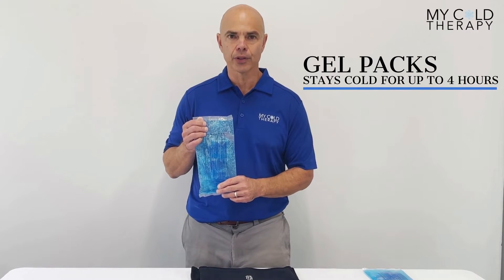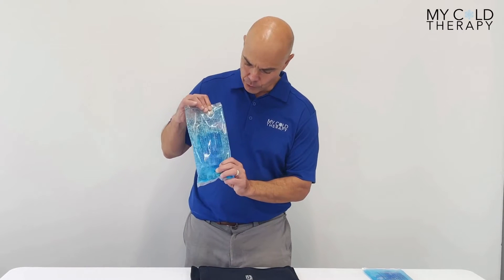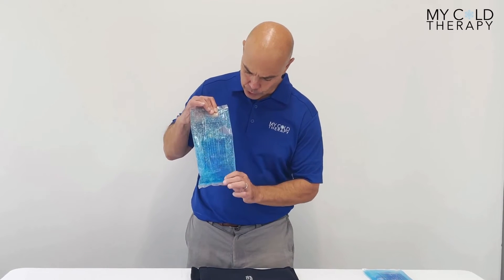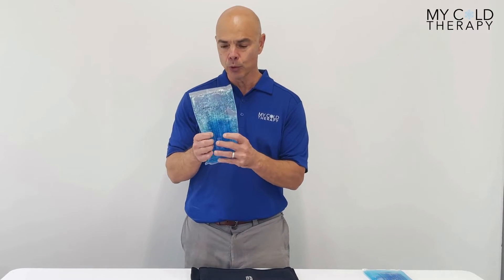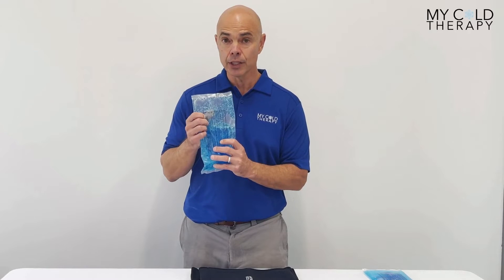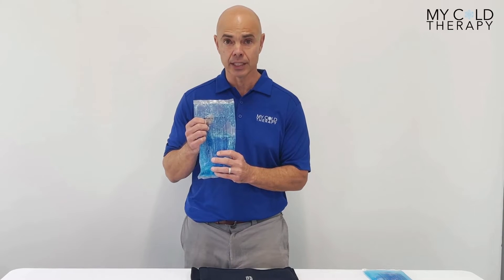This wrap stays cold for up to almost four hours and it's fully moldable. As you can see in the video, there are two different color blues inside the gel pack. It allows the pack to be moldable while it still stays cold. This is really the only wrap on the market that does this and stays cold this length of time.